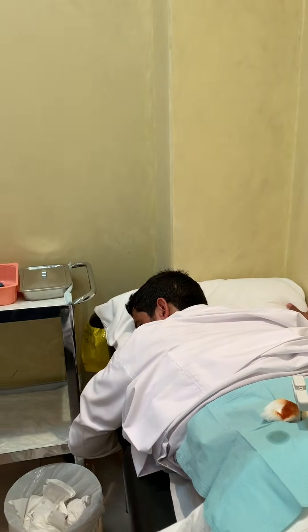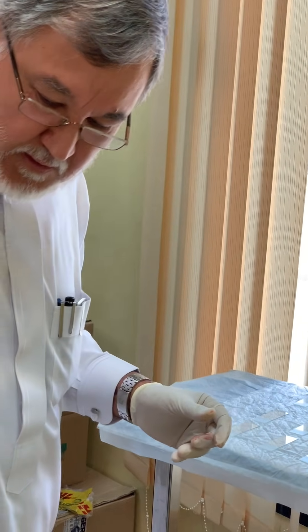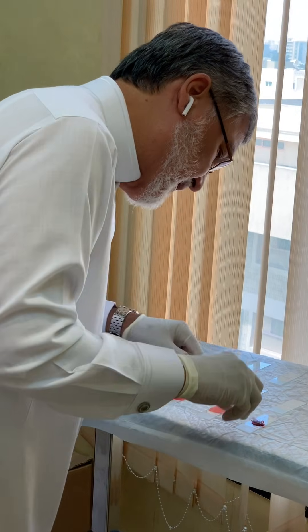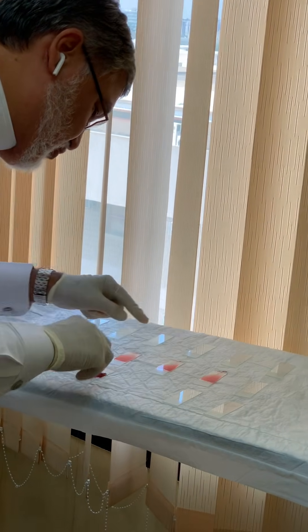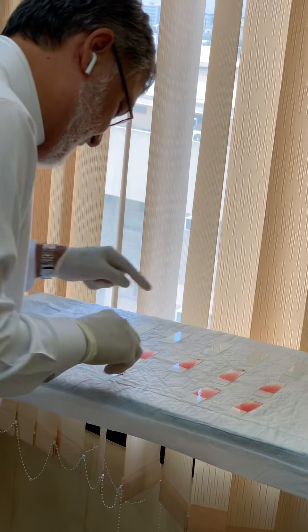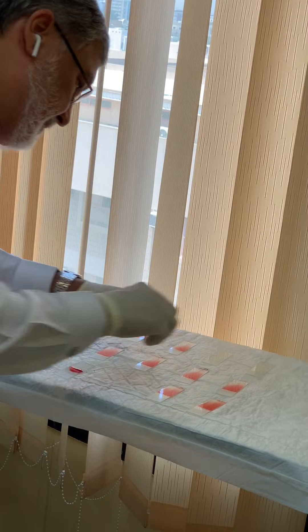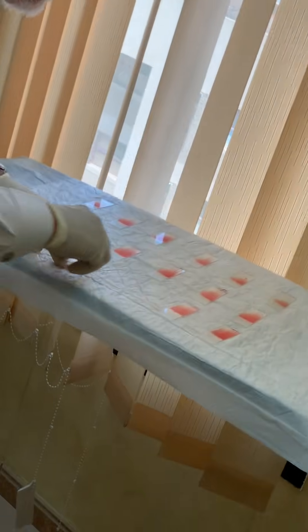During the aspiration the patient will feel pain, so I will inform him first. Then we will make the cytology smears — give me the CBC tube. We extract the sample and immediately make the smears. This is of course a technical job; sometimes having a lab technician helps, but as a hematologist I have also developed the technical expertise to prepare fresh, beautiful slides — and we got beautiful slides today.